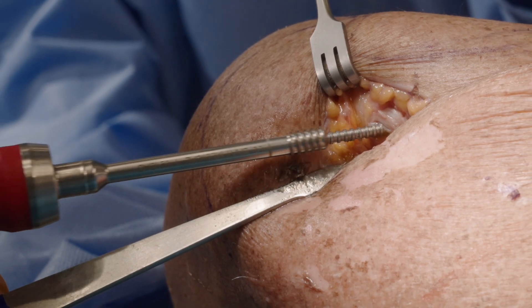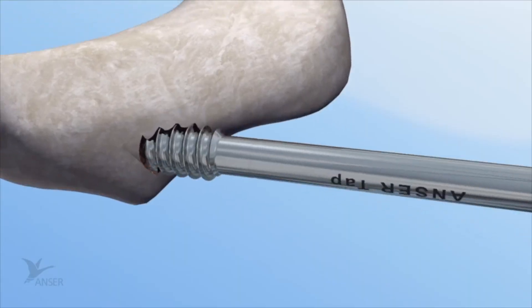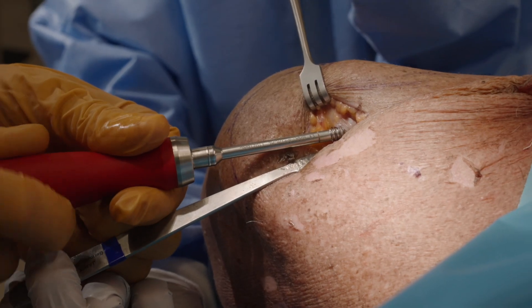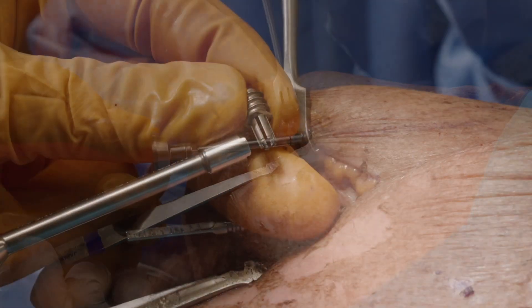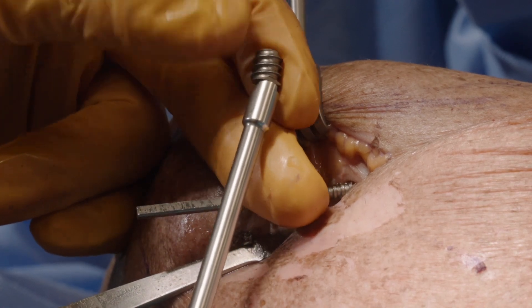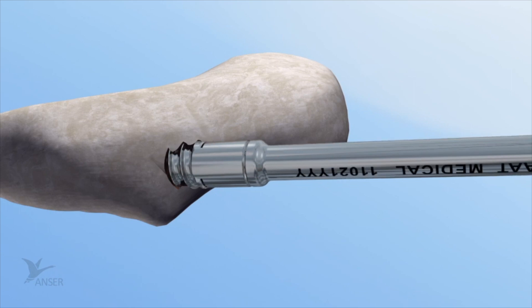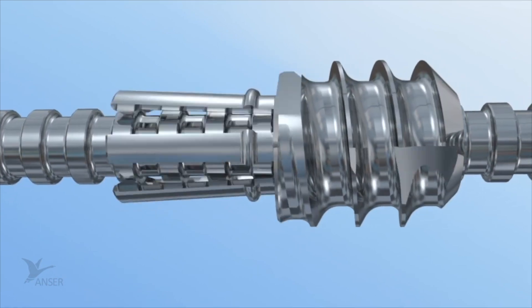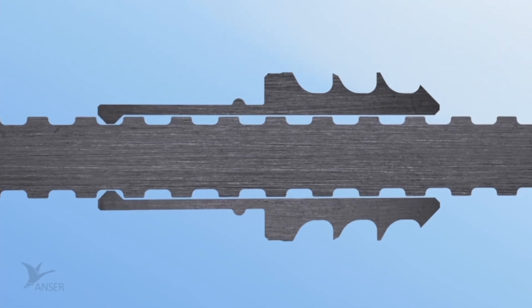Now the Anser tap is used to prepare a functional thread in the cortex of the posterior conoid tubercle. This will facilitate placement of the Anser lateral fixation device. On occasion it may be necessary to apply gentle collinear force onto the tap in order for it to engage the cortex. Use the cannulated Anser lateral fixation device inserter to place the Anser lateral fixation device over the Anser clavicle pin. While advancing, the exterior thread will anchor itself in the cortex of the posterior conoid process creating the lateral fixation point. Make sure the six resilient legs of the Anser lateral fixation device have positioned themselves in one of the indentations of the Anser clavicle pin.